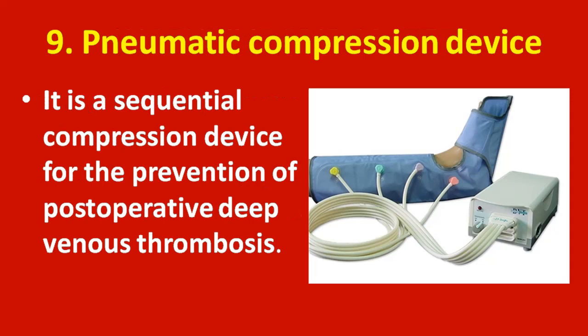This slide shows pneumatic compression device. It is a sequential compression device for the prevention of post-operative deep venous thrombosis. It is applied to the lower limbs and it prevents post-operative deep venous thrombosis.